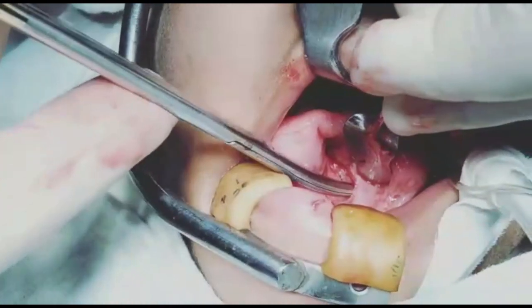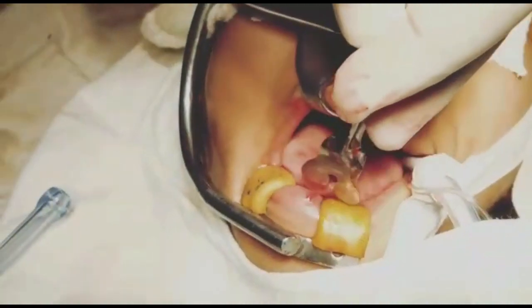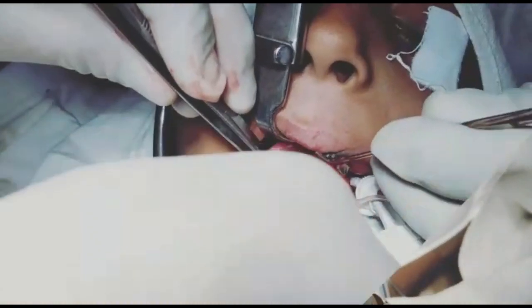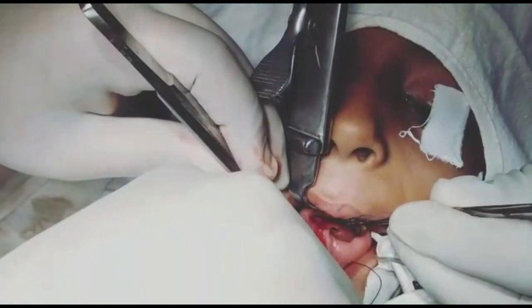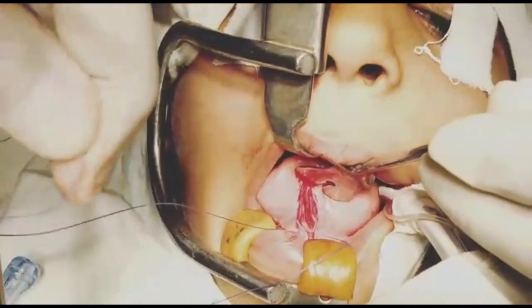Blunt dissection is also carried out. There is none to minimum bleeding in this sort of surgery. As you can see, I have used the Boyle-Davis mouth gag in a different way.